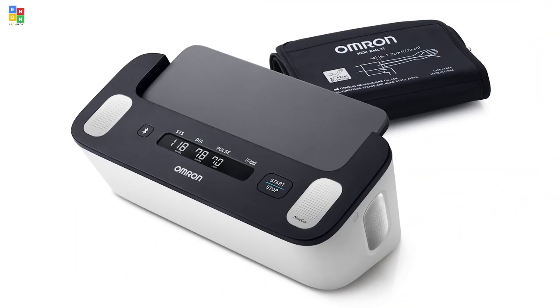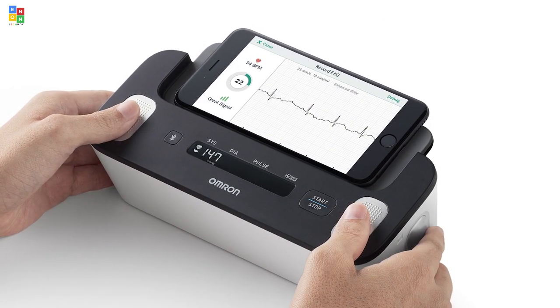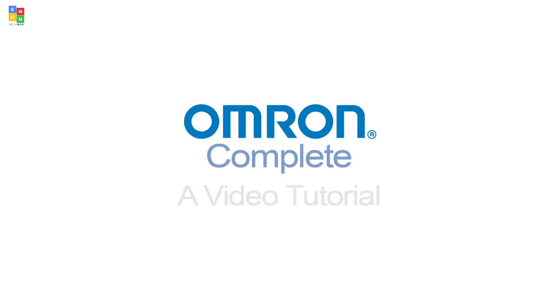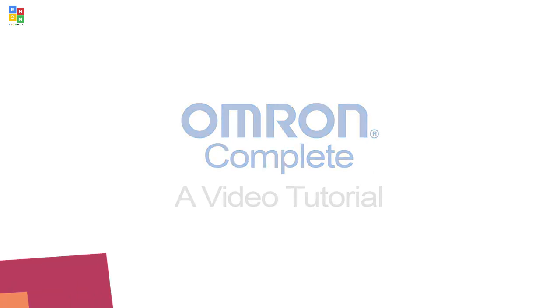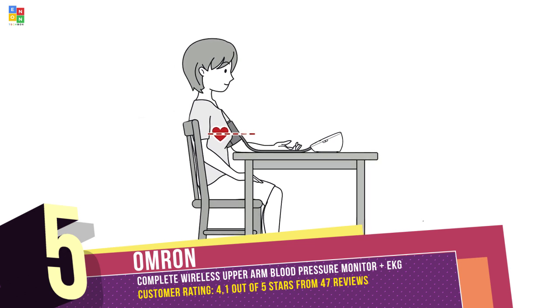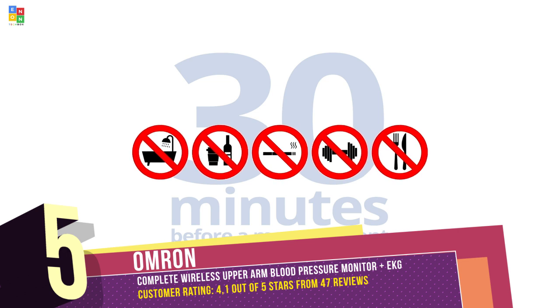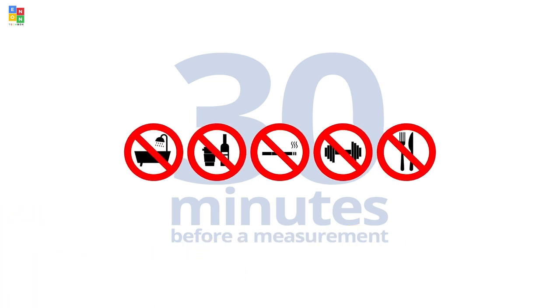Omron Complete combines blood pressure monitoring with EKG measurement in one easy-to-use device. In this short video, we demonstrate how to record measurements step by step. To ensure reliable readings, sit upright on a chair with your feet flat on the floor. Avoid bathing, drinking alcohol or caffeine, smoking, exercising, or eating 30 minutes before taking a measurement.